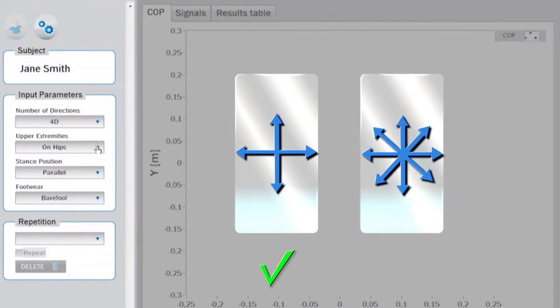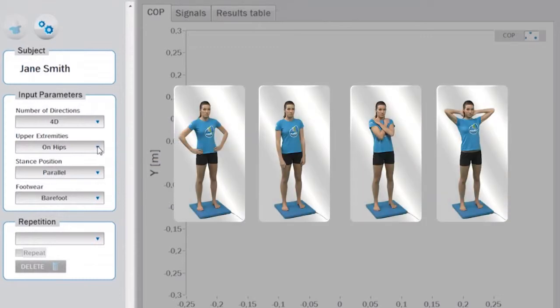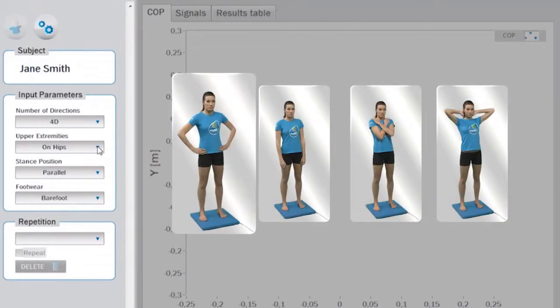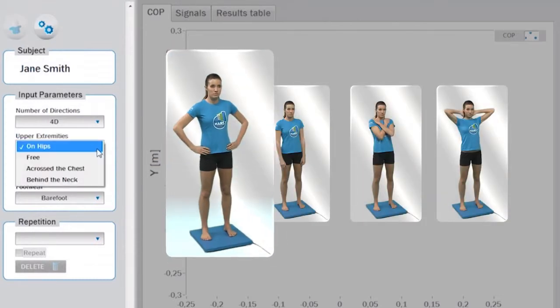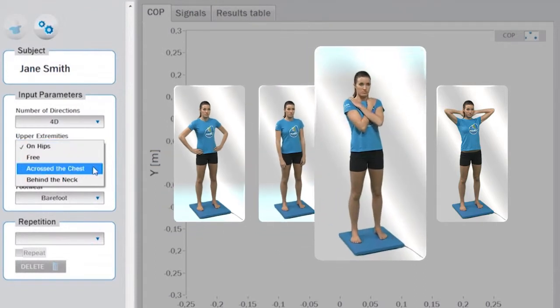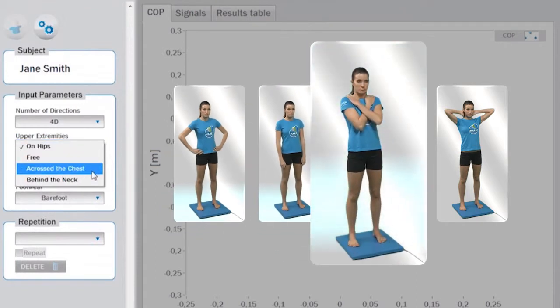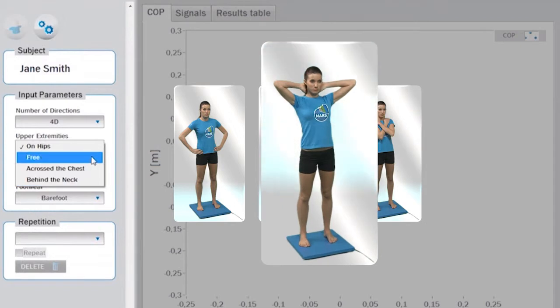Then define the position of the upper extremities, where you can choose among hands positioned on the hips, freely positioned, crossed over the chest, or positioned behind the neck.